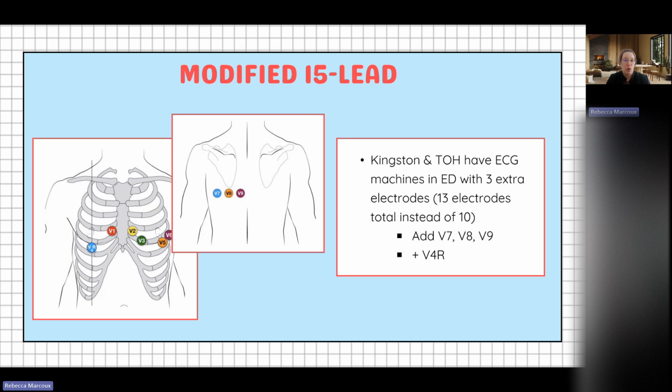So please know what you do at your organizations and in your units. I worked in ICU and this is not our practice in ICU because we don't have a 13 electrode machine.